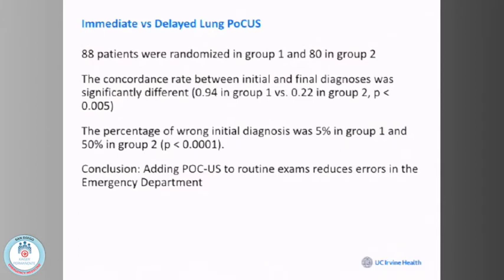And it could have been one of those things where they were trying to throw the results, like the Hawthorne effect. I could see the people involved in the study knew what they were doing, and maybe they gamed the system a little bit, because it's just ridiculous to miss it by 50%. But bottom line is, I think POCUS reduced the errors and made them more accurate.